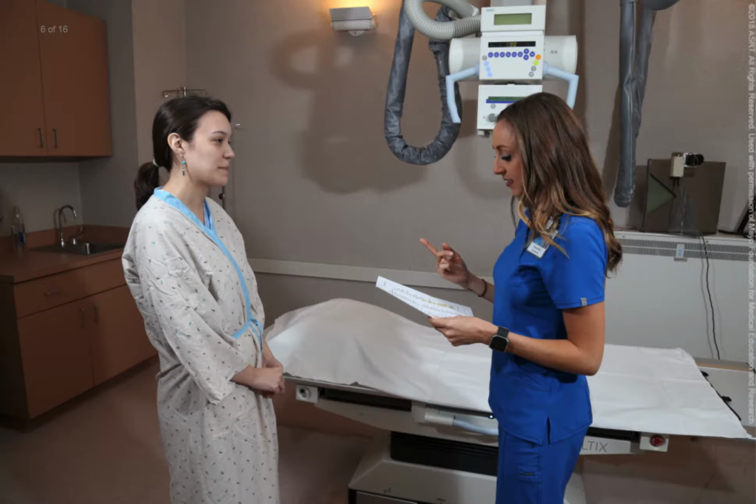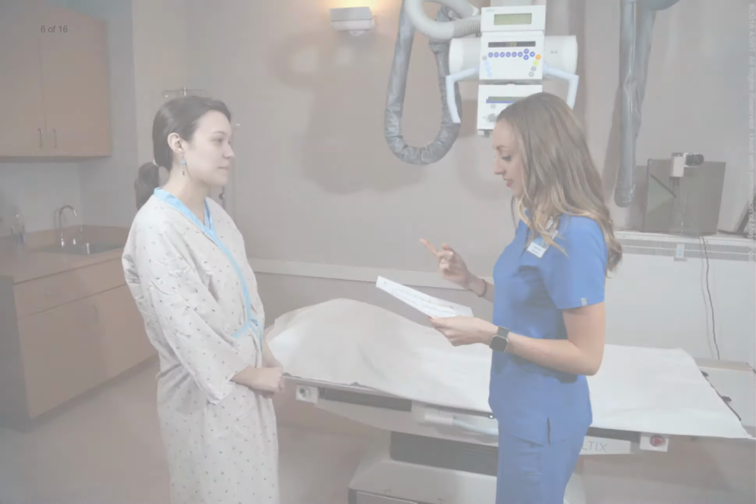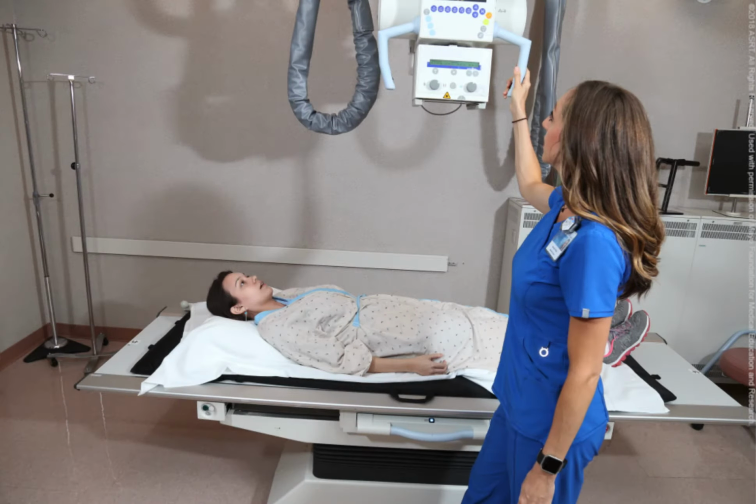Patient history should include a discussion of any known anatomical variants that may impact the exam, as well as any medical devices implanted in the area of interest. For example, technical factors will need to be adjusted if a patient has a joint replacement or severe arthritis. Patients should remove clothing and jewelry in the area of interest and should be provided with a gown to provide privacy and prevent the patient from getting cold.